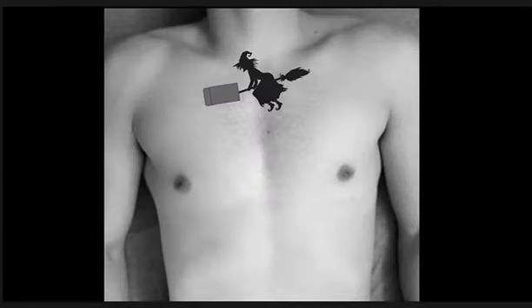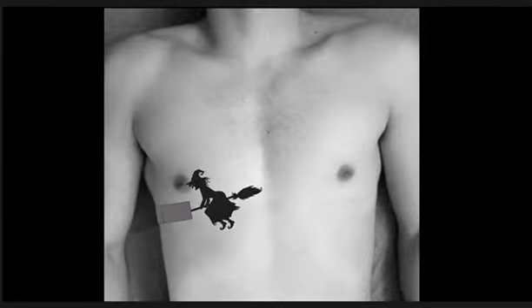Here's how you'd find the lung point. Say you didn't see sliding at the point of where that probe is at the top part of the chest. Slide the probe lateral and down to try to find the view where part of the lung is moving and the other part is not.